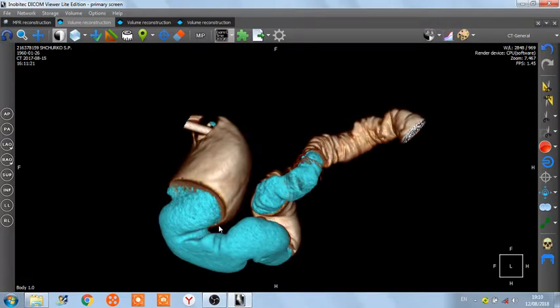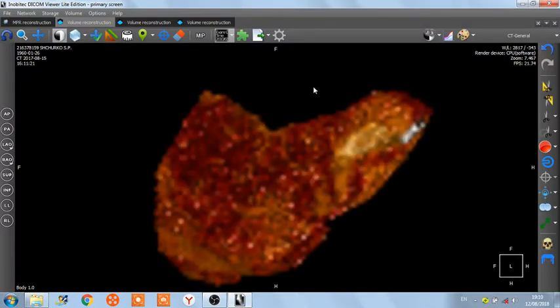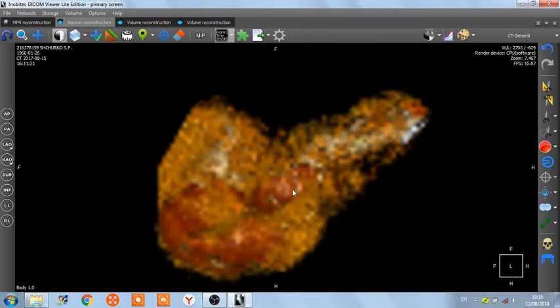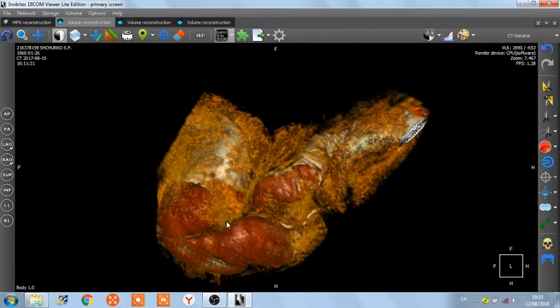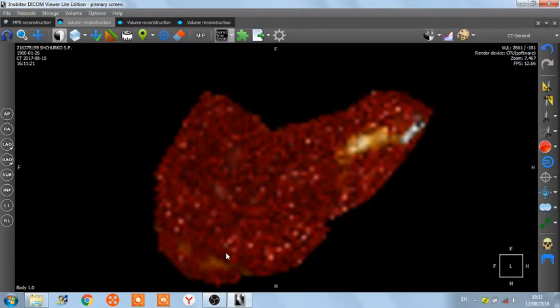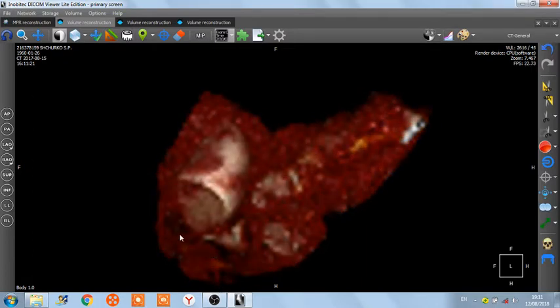I can show with one frequency the damage what the arteries make there, and with the other frequency I can show arteries which come in that way inside, and they go around it here.